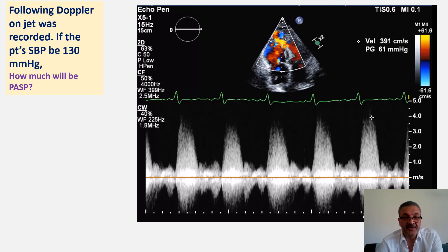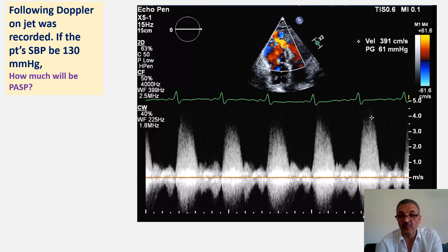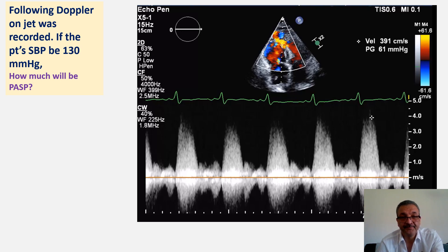Using continuous wave Doppler on that jet, how much will the pulmonary artery systolic pressure be on this patient? Assume the systolic blood pressure of the patient is 180 mmHg. You can use a calculator or whatever method you prefer.